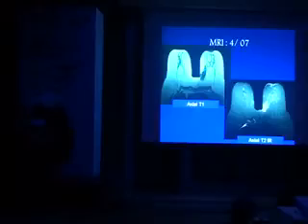This is essential. No MRI, please, no MRI without intravenous contrast. No one should come to you saying, please, I want to do an MRI, but I don't want to take any contrast. Go home, don't do it. Sometimes the only exception is when we really need to assess, for example, prosthesis rupture. I don't find any other indication for that. And even then we should also inject contrast, because maybe she has a cancer and we are just focusing on finding capsular rupture. Anyhow, these are the images.